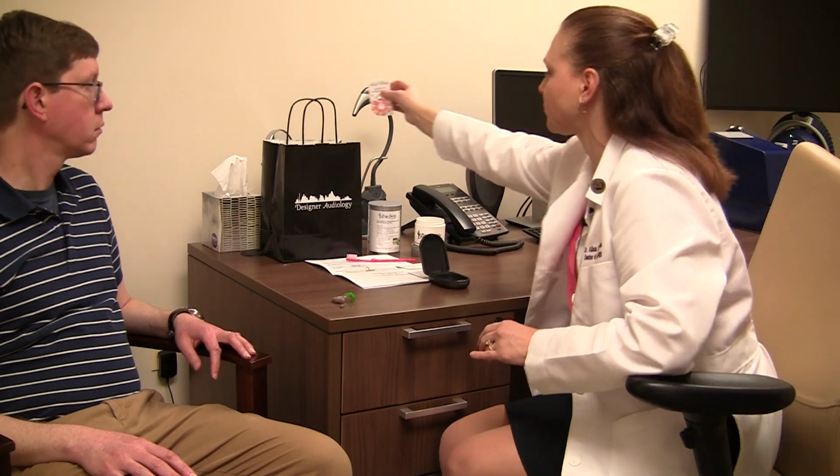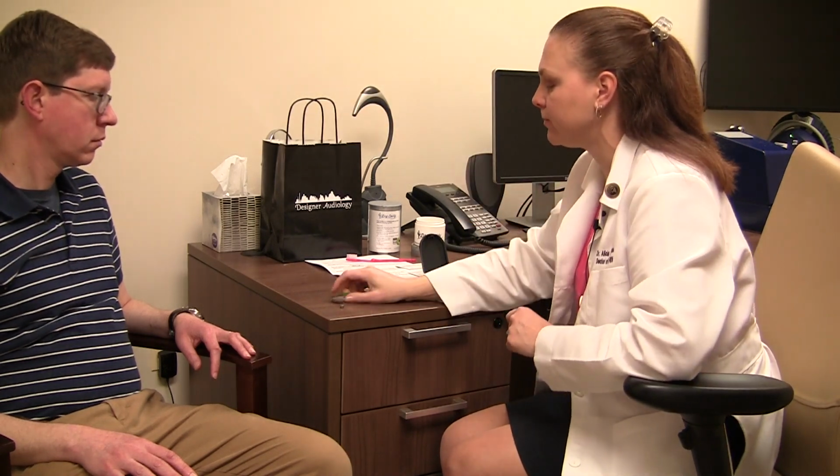My public service announcement when it comes to batteries though is make sure you keep everything away from kids, pets, keep them away from your medication, make sure nobody can swallow them or eat them. There's no mercury in them, but they're still not good for us. So there's a pack for you.